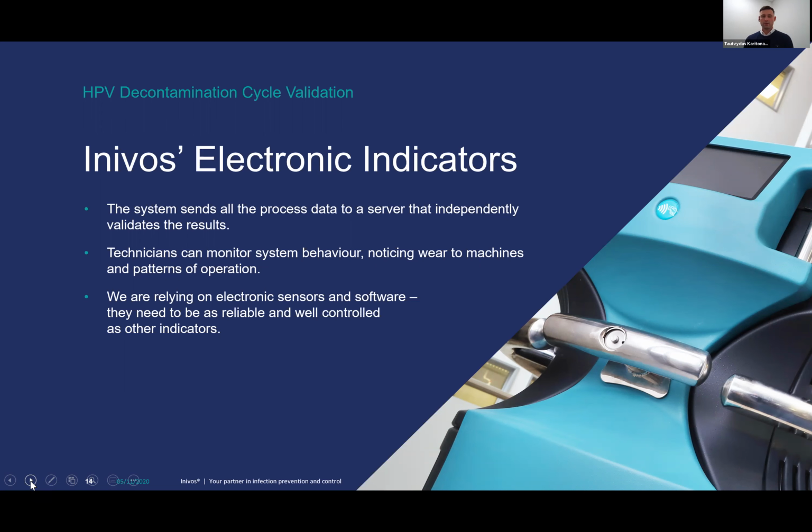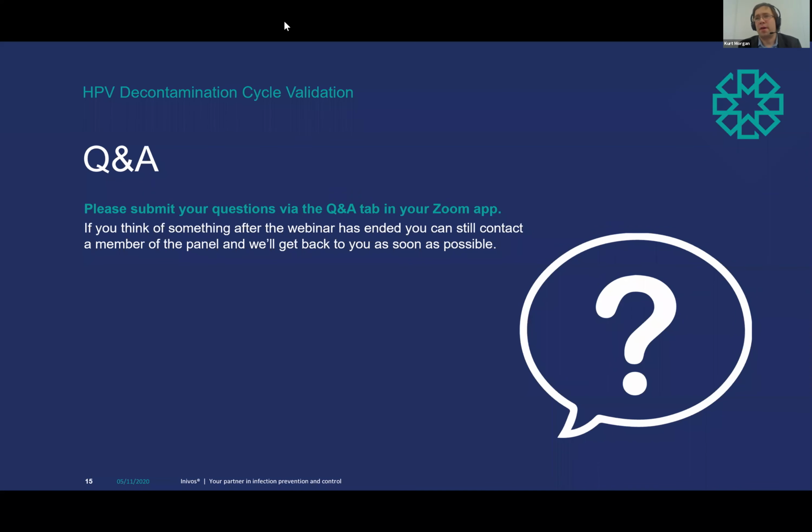We have regional hubs where our technicians are responsible for a particular set of machines, and they pay careful attention to what's going on day by day to see which machines are being used, and they're alerted immediately if any cycles have failed. So the technicians go and look at the detail of the sensor readings to try and figure out what's going on, and many times they've been able to phone up the individual operators and find out what's going on and help them to make sure that processes are completed every time. And if they're not able to do that straight away, they can often figure out what might be wrong with the machine and then make sure that they can go and service it with the correct parts straight away.